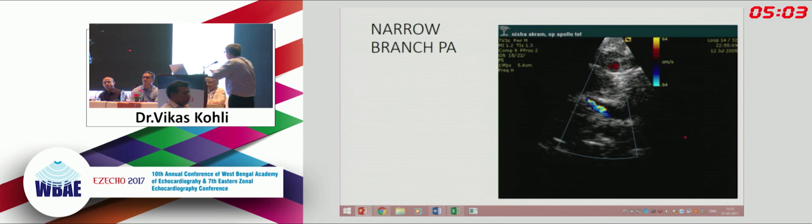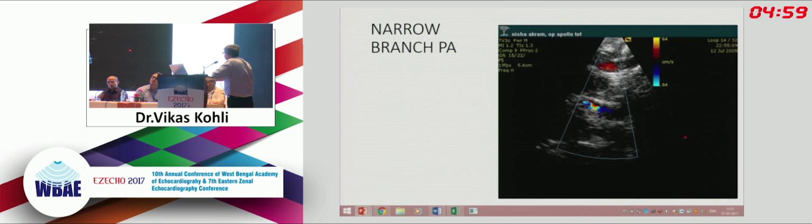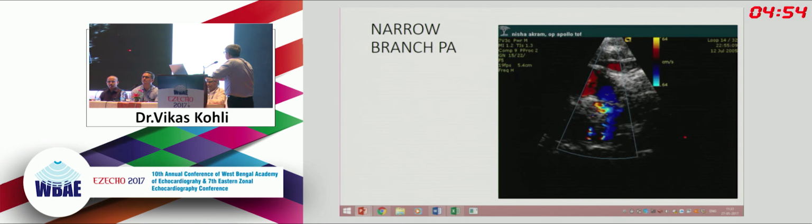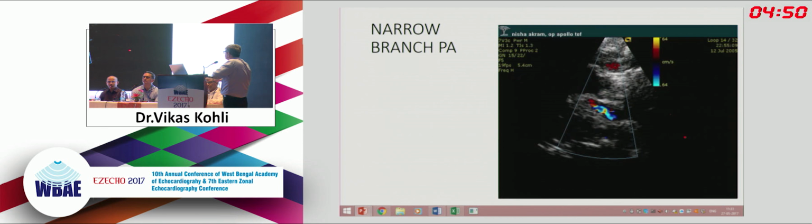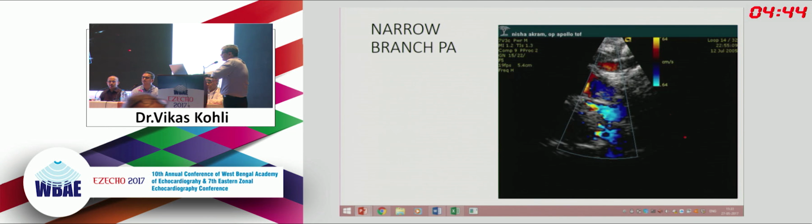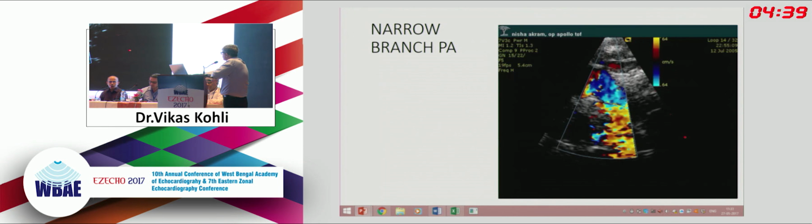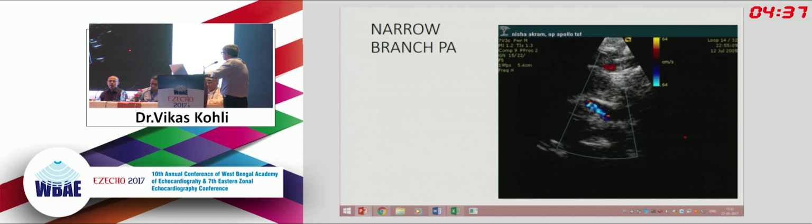So this is the left pulmonary artery. This is another view of the suprasternal view. When we rotate it clockwise to see the branch pulmonary arteries, especially the left pulmonary artery, we can slide towards the left clavicle, so the left pulmonary artery can be visualized in length. Similarly, the transducer can be moved towards the right clavicle, depicting the right pulmonary artery. Here, there is the best assessment of the branch pulmonary arteries, which are usually 1 to 2 millimeters higher than in the short axis.